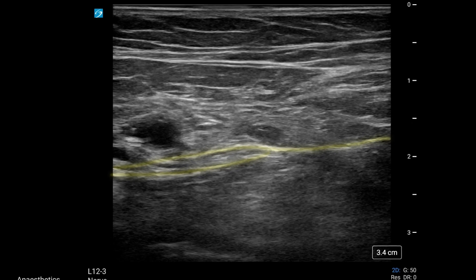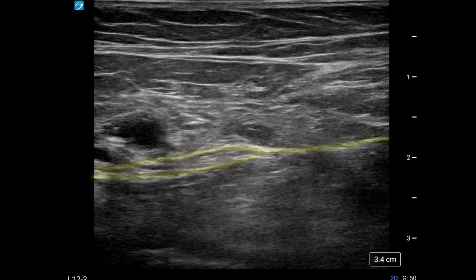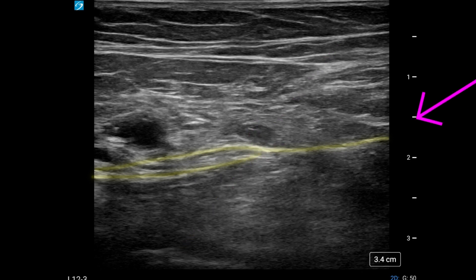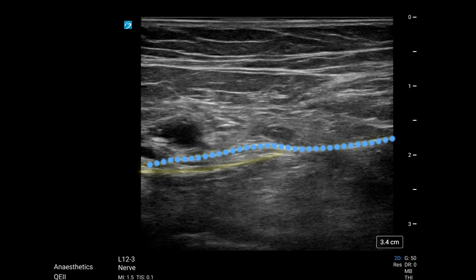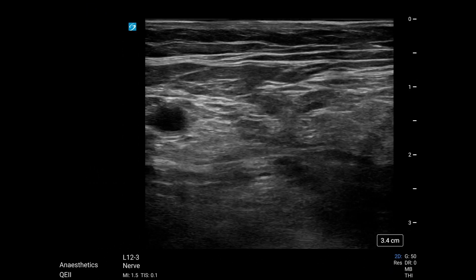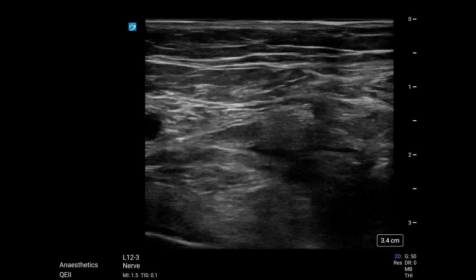We now have to consider the needle approach we're going to take. We can come in steep next to the nerve, or more lateral, aiming for the fascia iliaca, and using some local anaesthetic to hydrodesect that plane, and then advance our needle through that plane. We weren't absolutely confident that we'd found the nerve and there was something not quite right, so we went with a second option — came in laterally and hydrodesected.